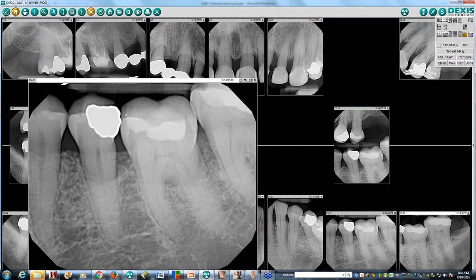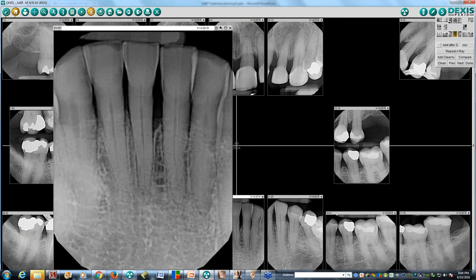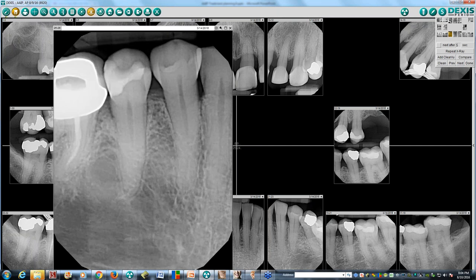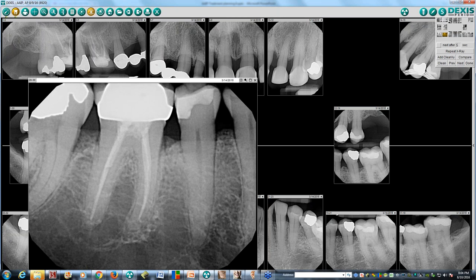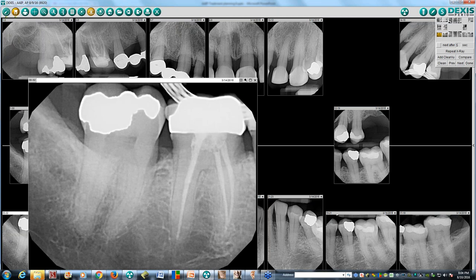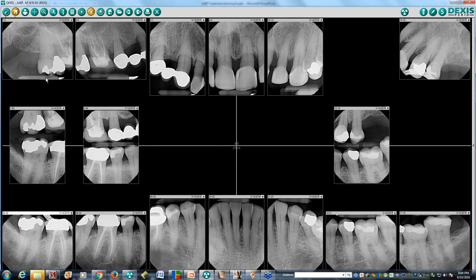Tooth number 18 is super-erupted, and tooth number 19 is back into the occlusal plane with circumferential bone loss around tooth number 20. Tooth 21 is okay. There are concerns in the anterior, particularly with tooth number 25. In the lower, there's reasonable bone support — we can help this case. In the upper, maybe yes, maybe no. Take a look at the root spacing and the over-contoured crowns placed to close the diastema. Some of this bridge work is 40 years old.